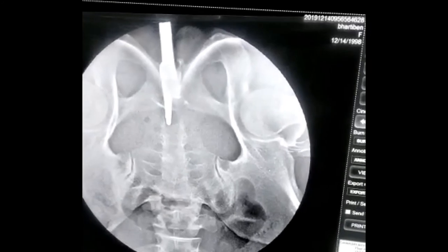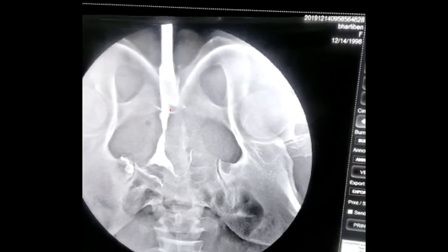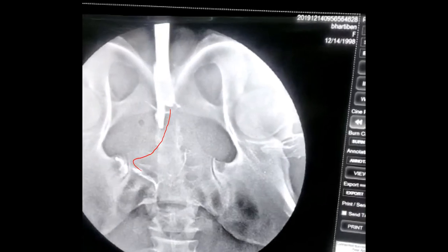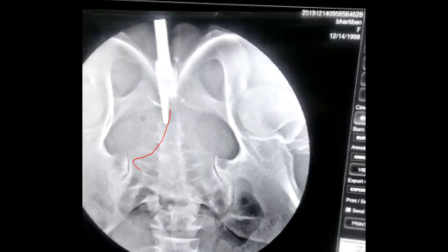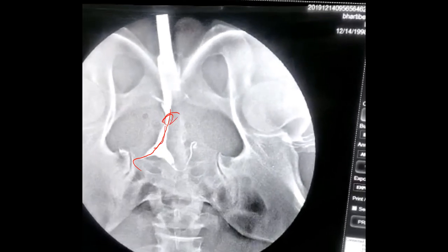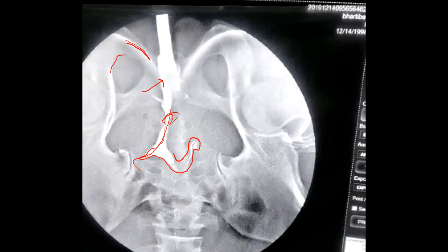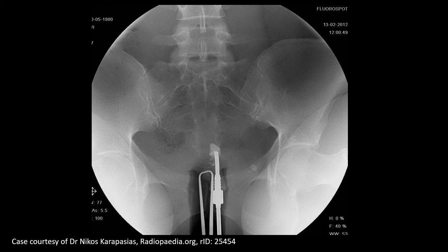This video shows the dye injected through the cannula, passing through the uterine cavity and then through the fallopian tube. The cannula is visible here. This is the inferior pubic ramus and this is the obturator foramen. This represents the lower part and the upper part of the pelvic cavity. In this image, you can identify the cannula as seen in the previous video, and this is the vaginal speculum.